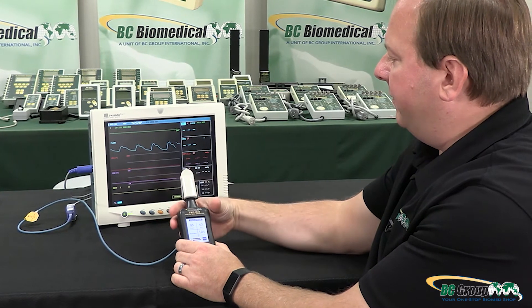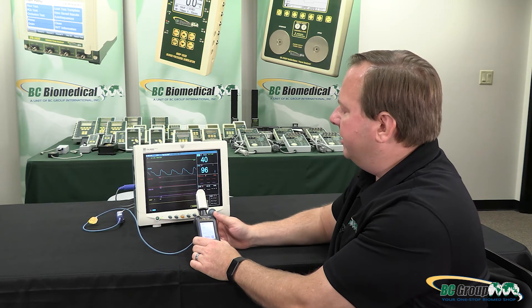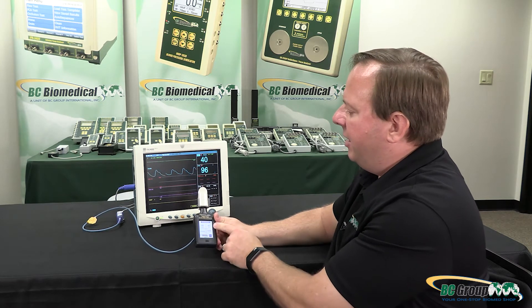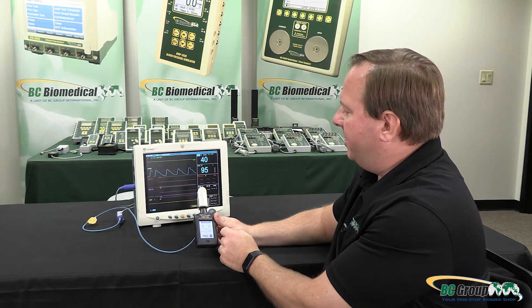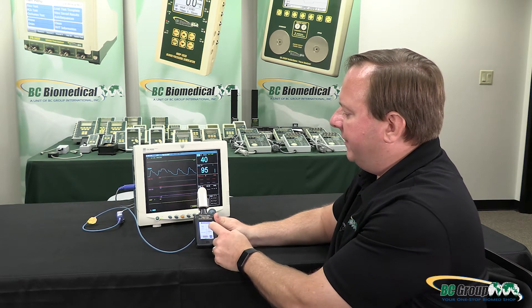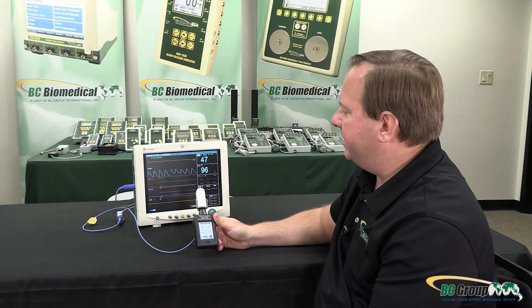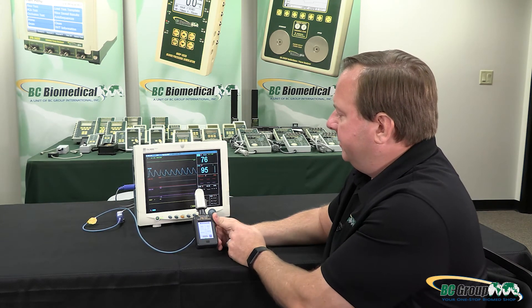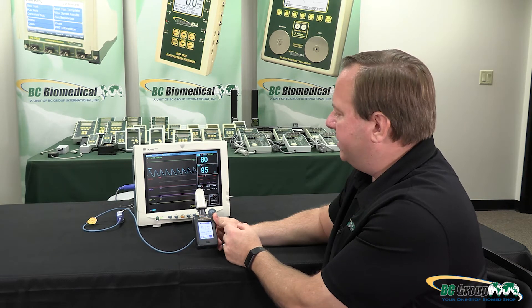Now I should be able to see a reading on the monitor. It usually takes a few seconds for it to stabilize and calculate the rate. Here I have it set for 40 beats per minute and 95% SpO2 — that looks good. If I change the heart rate we can see the signal changed on the monitor and the heart rate is increasing; there's a bit of a delay in the monitor. We wait a few seconds and we'll get the new reading — there we go, 80 beats per minute, 95% SpO2.